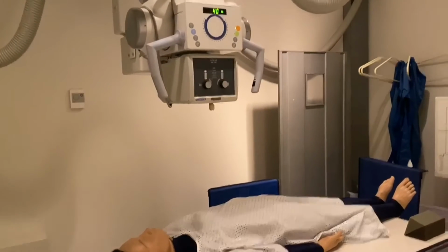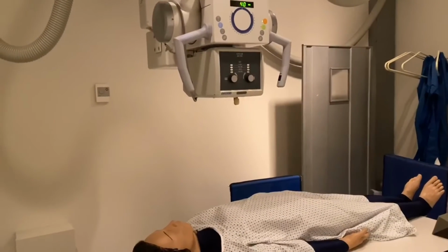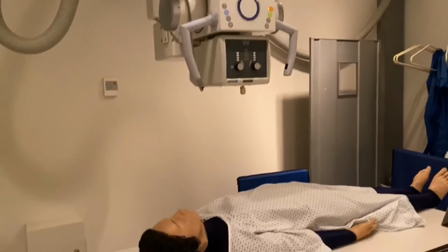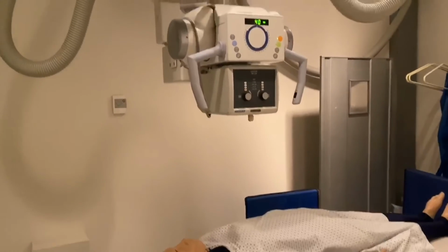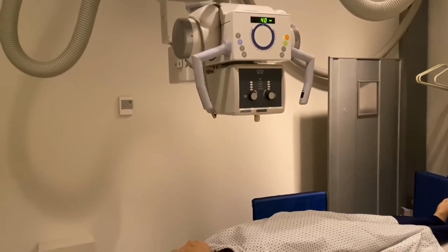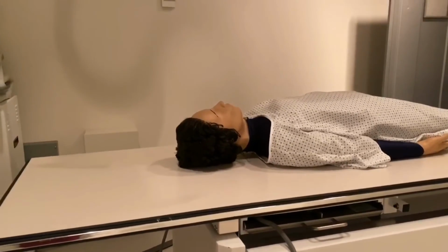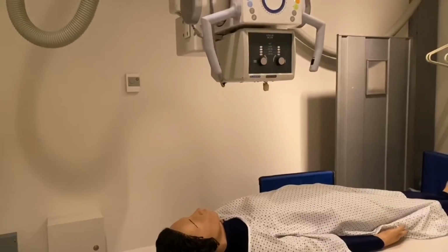Okay, so for objective 2 for this week, we're going to be doing peer review and making sure you guys know how to use the Bucky. So we're going to have Annie on the table, 40-inch SID. Remember, that's going to say 40 inches up there because it's measuring to the Bucky. Remember, you're going to put your Bucky all the way to the very top of the table and then slide Annie as far down as you need to get her centered onto your CR.